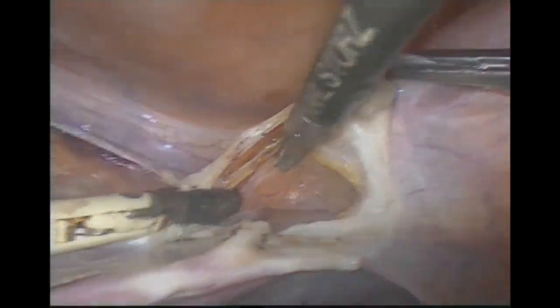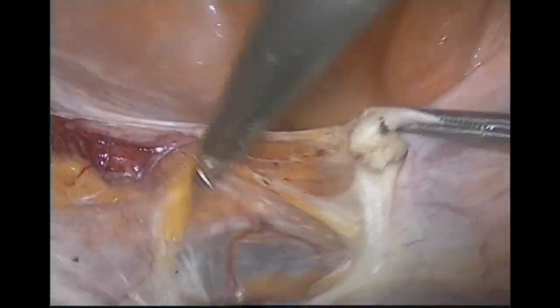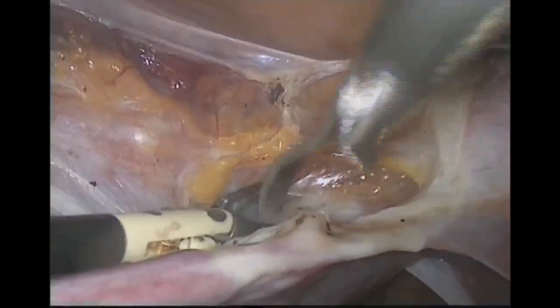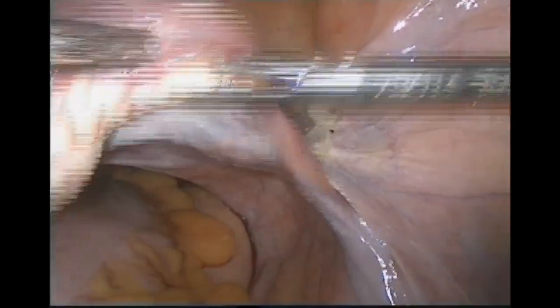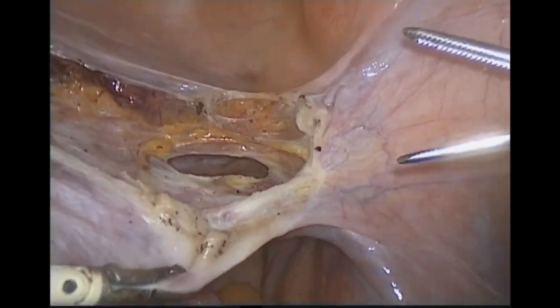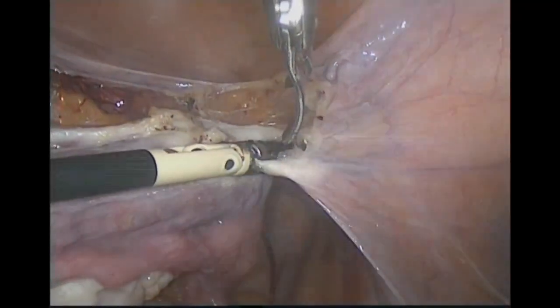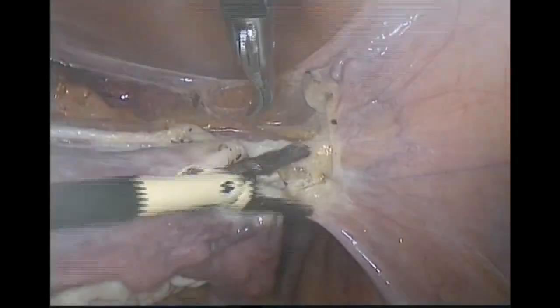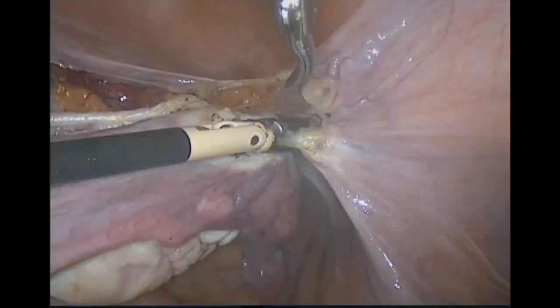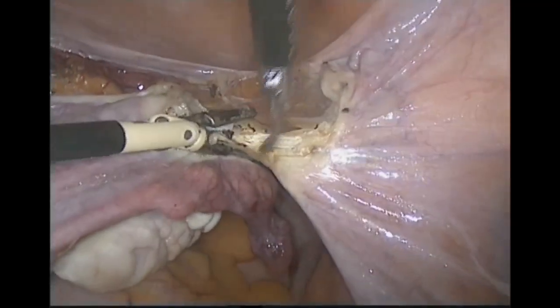Go to the round ligament, coagulate, and divide it to open the broad ligament as before, in the gray zone, which is the zone underneath with no intestinal loop or important structure. Go to the IP ligament like this to see the ureteric peristalsis and the pararectal and paravesical spaces. If you need to go extraperitoneal, you can from here, but this is what's called simple, systematic TLH.